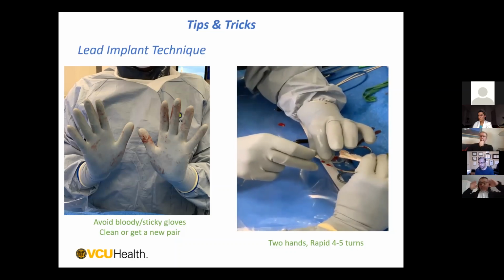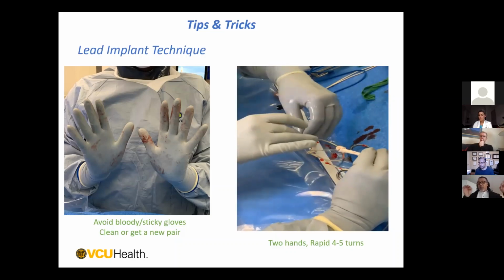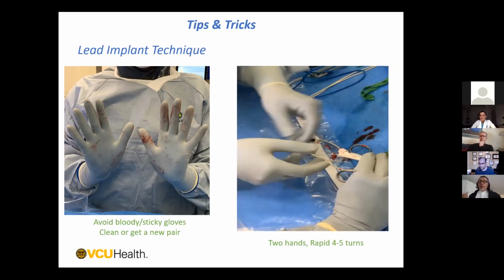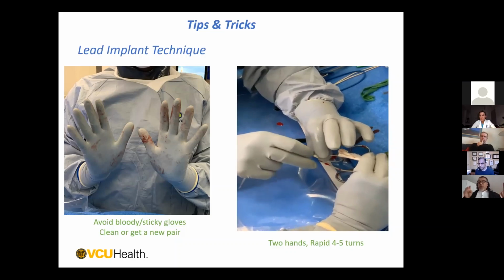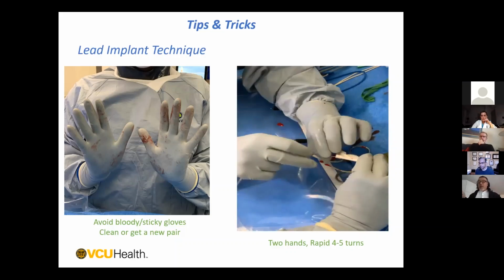Actually, it helps me to make it a little stiffer also, as you mentioned, because instead of putting a wire, I just put my lead inside. And it saves me some fluoroscopy. I don't like fluoroscopy. It saves me like 1 or 2 minutes of fluoroscopy, because I know that once I'm in there, I start turning. And the other thing, if it is not advancing, if you have recoil, I change the place.